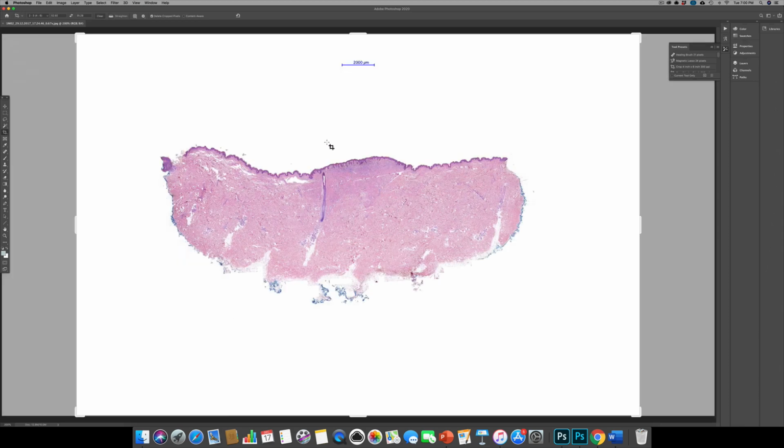Now it's a lovely photograph. It's beautifully focused. It's nice color, but I think we can make it better. And the reason I want to make it better is just to demonstrate to you how you can make out the silhouette better by playing with the image a little bit.